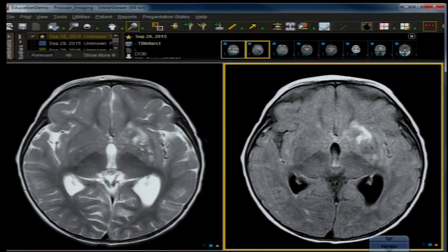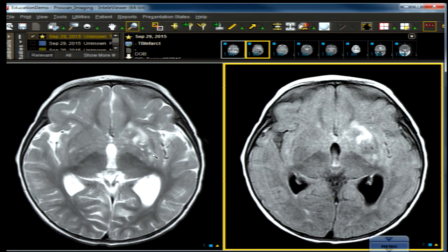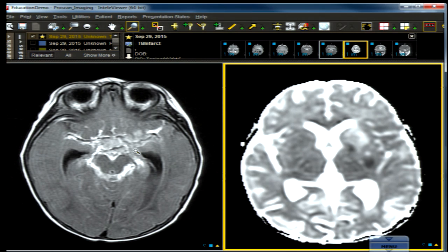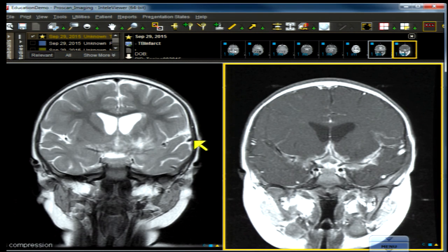Welcome to our neuroimaging board and recredentialing review, focusing on infection and inflammation. We have an adult with third nerve palsy, headache, and high fever. Let's look at the images: an axial MR T2 water-weighted, a fluid attenuated or FLAIR image on MR, an axial T1 MR without and with contrast, an axial T1 inversion recovery with contrast, an axial diffusion weighted image, and two coronal images — a coronal T2 MR and a coronal T1 contrast-enhanced MR.